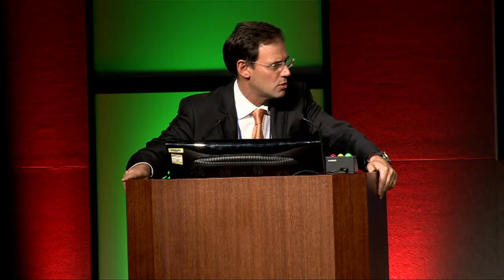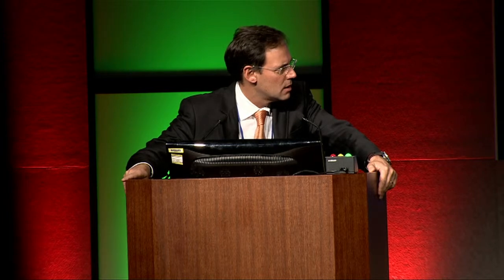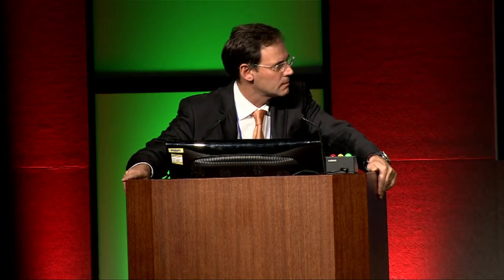Just technical, I understand the logic, I'm just getting technical details. So you have a 4 millimeter Pedra that goes up to 4.7, at 14 atmospheres. Yeah. The 3.5 goes up to 4.2, 4.3, and that goes down an 18 gauge needle. Exactly, yeah, the 4 millimeter. Fantastic. Thank you very much indeed.